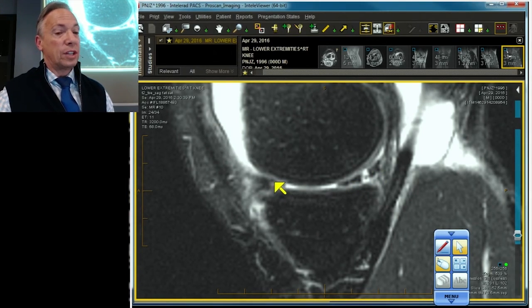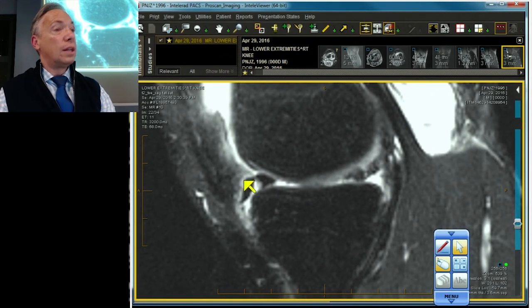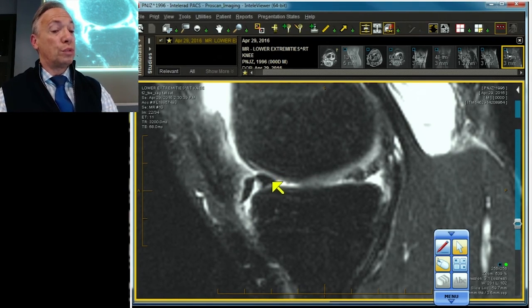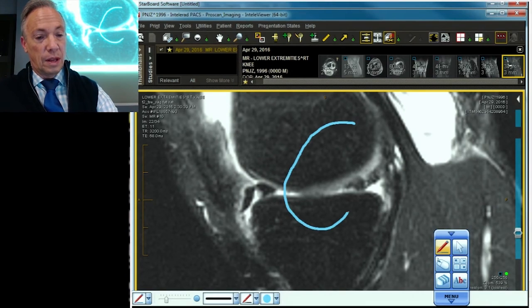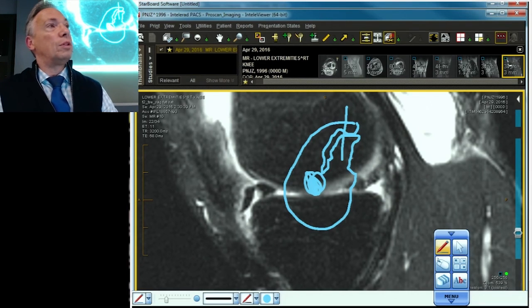There are two structures there, just like we said — the double anterior meniscus sign. A portion of this bucket handle tear has pushed forward. The portion that's pushed forward is here; the native meniscus is shoved all the way in the front. You've got your bucket pushed forward, there's your native meniscus, and here's your big hole. There is your double meniscus sign.